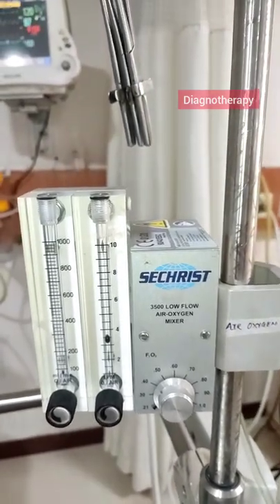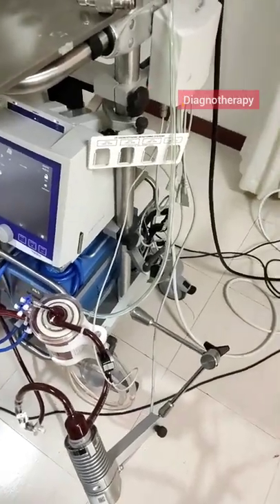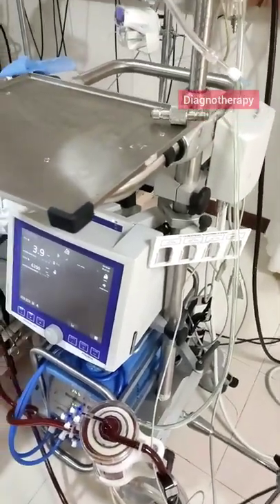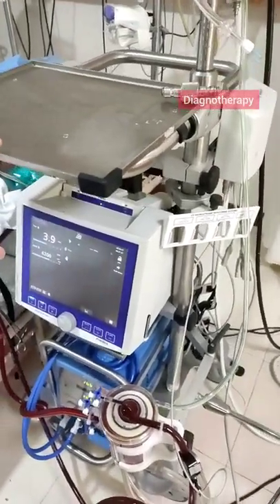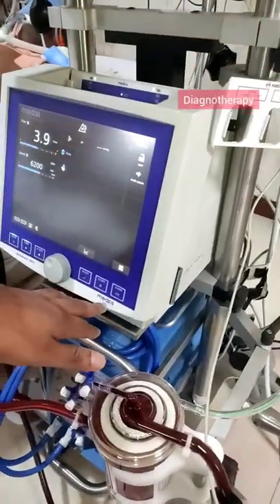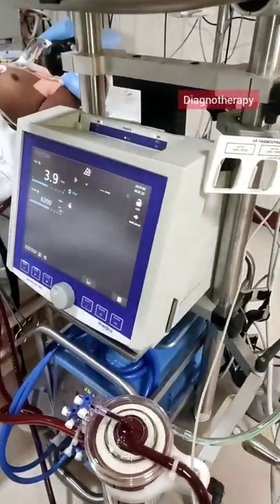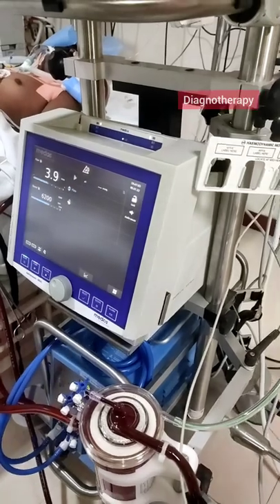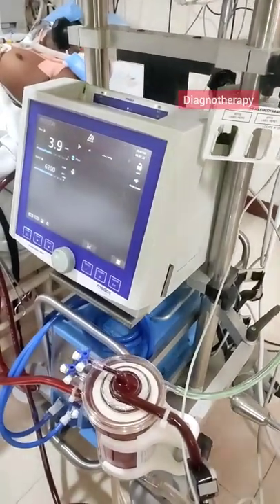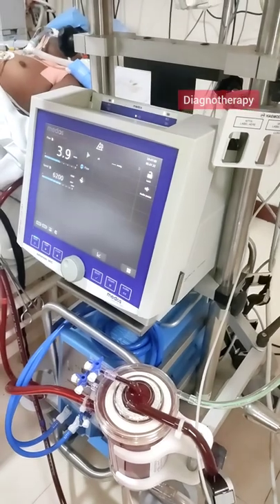The same type of setup is also seen in heart-lung machines. On the front screen of the ECMO machine there is the brand badge, and there are switches for setting the RPM of the rotor. You can see there are different values of RPM that can be set.